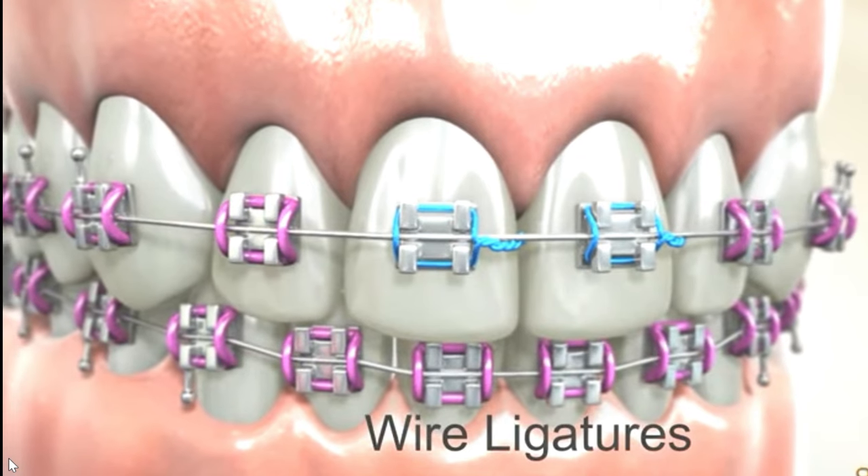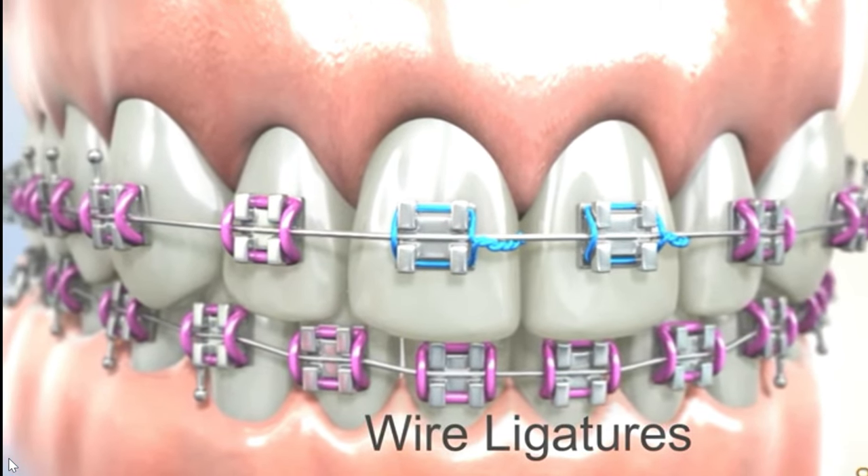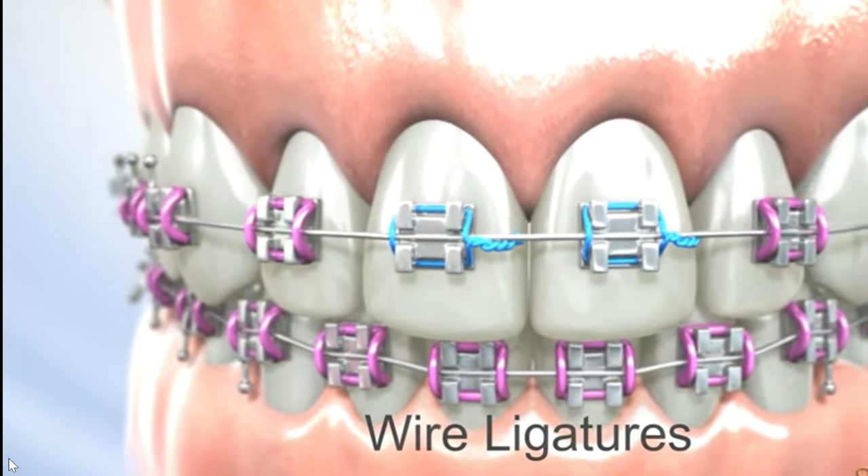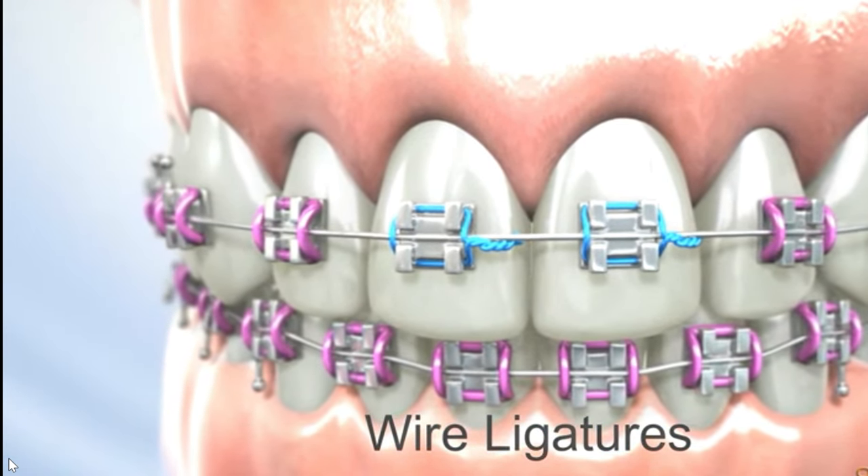Ligature wires are small wires used in orthodontic treatment to secure the arch wire to the brackets. Ligature wires are secured to the brackets using a twisting or looping technique.